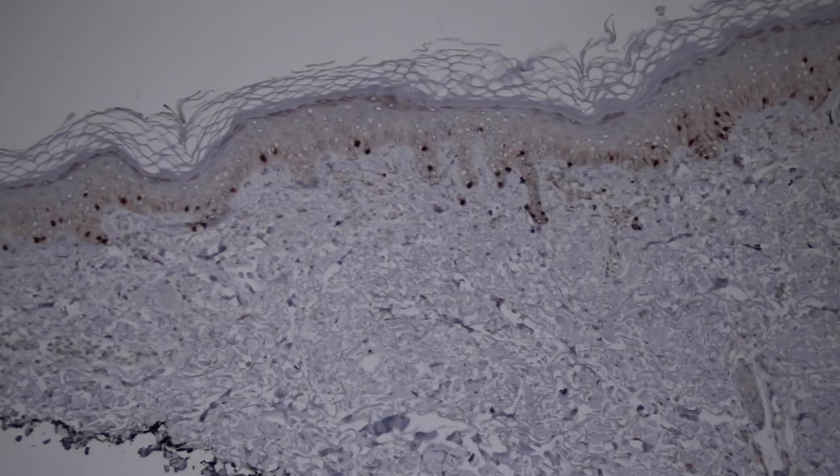All right, and one other immunostain to show is a stain called Sox-10, and it's a nuclear marker, it's a protein that's in the nucleus of melanocytes.